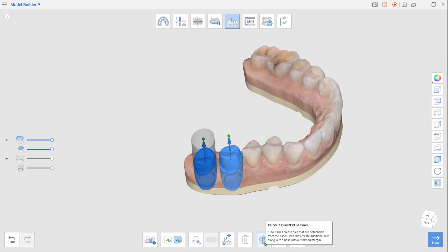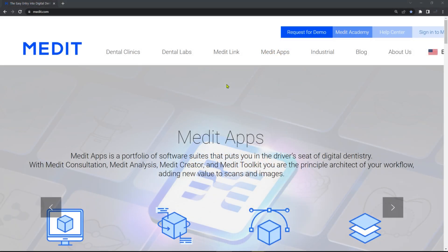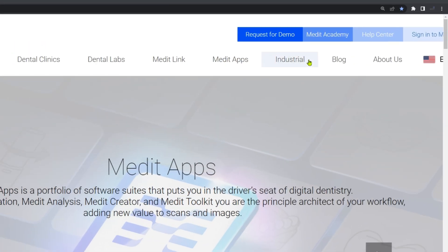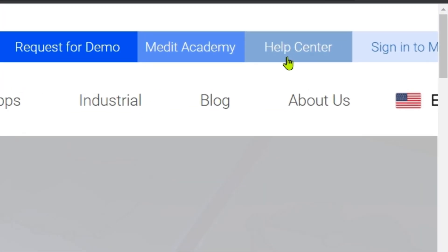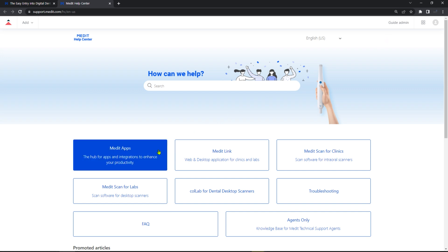Finally, adjust parameters for the die fit using Die Option. To have the best result when printing with your specific 3D printer, check out our partners' recommended parameters in Medit Help Center.